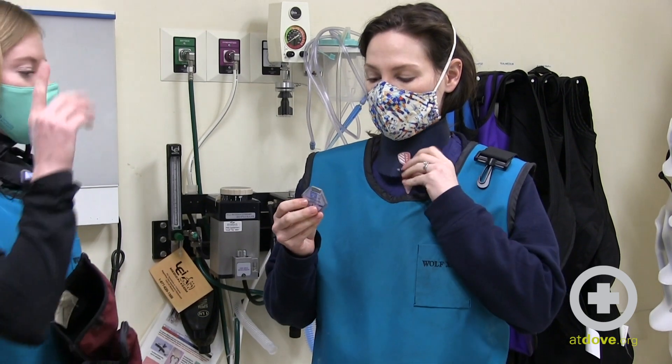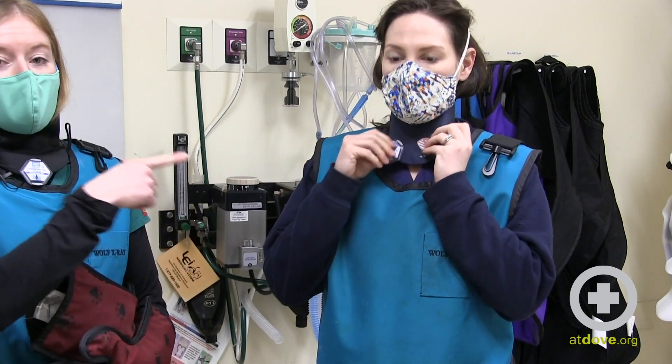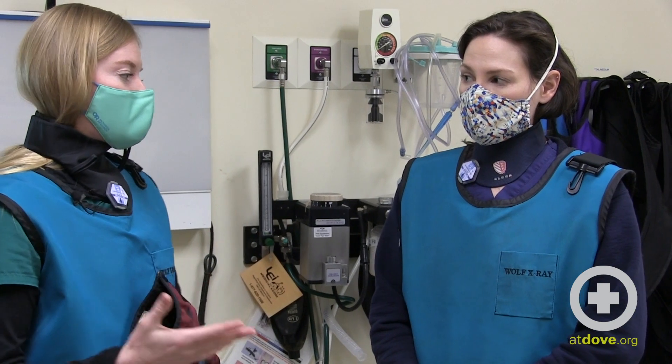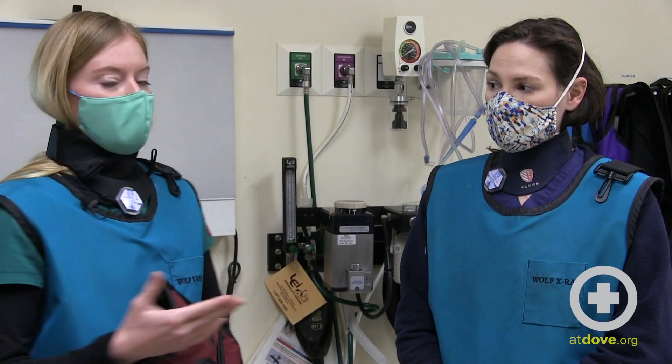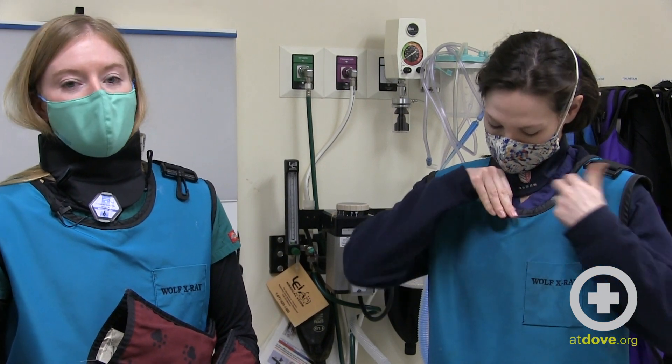Another really important part of your PPE is your dosimetry badge. Dosimetry badges measure how much radiation you're exposed to. These should be calculated — we do ours quarterly. Anybody showing high levels of radiation exposure should be asked to not take radiographs for a little while and wait for those numbers to normalize.